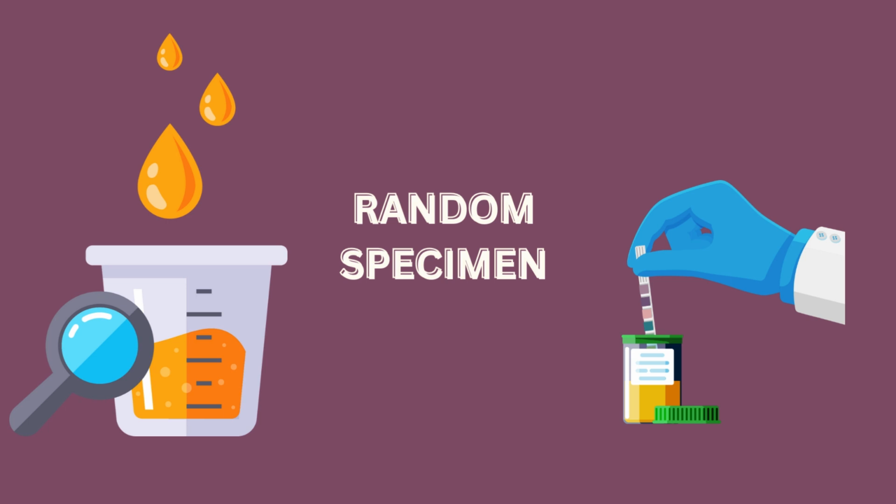So me as a medical assistant, I will go ahead and instruct the patient to void into a clean, dry, wide-mouthed container, and the urine is tested immediately at the medical office. So they will skip the actual part of cleaning their genital area, right? The meatus of their vagina, or if it's a man, their penis area, and they would just literally go ahead and void their urine in the container, right? So that's why it's called random, and it's basically done any time of the day.